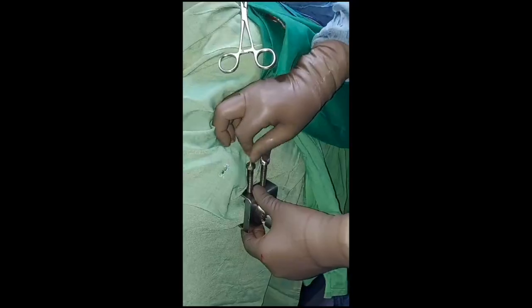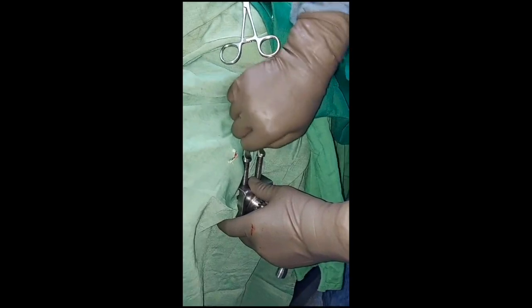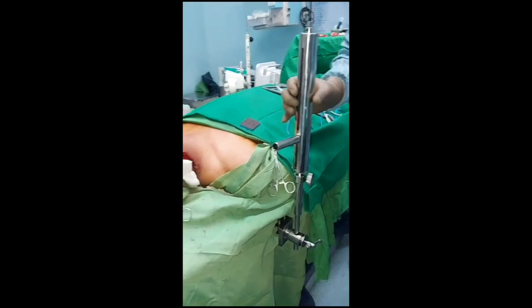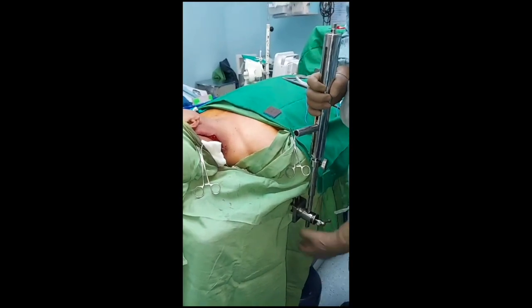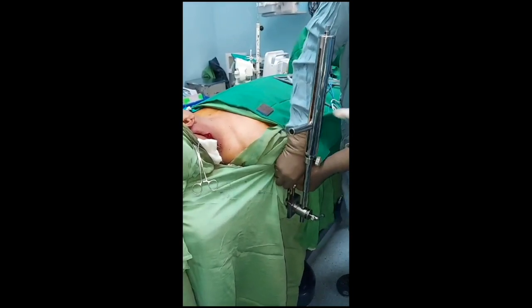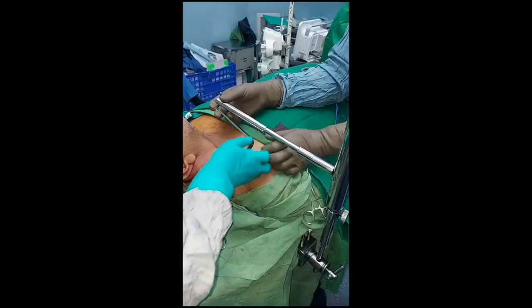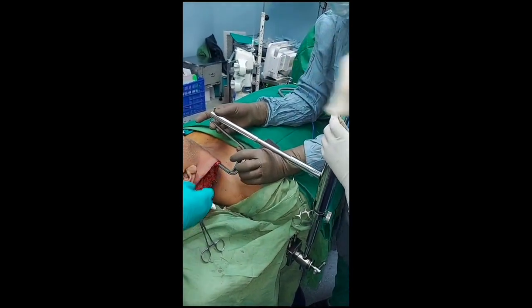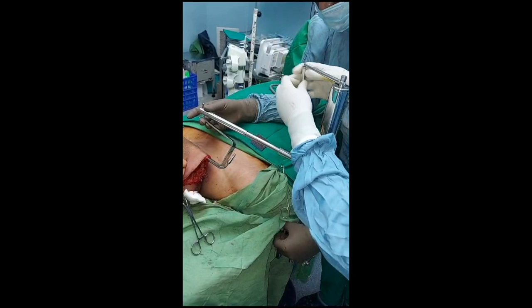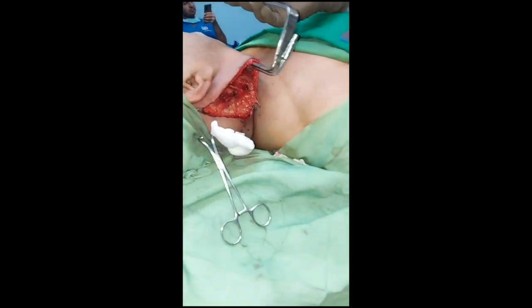Once you raise the flap, the next step would be fixation of Chung's retractor. So this is how we fix the Chung's retractor. Chung's retractor has got many blades, out of which my personal favorite is long one because of its reach. So these are the blades, and we fix the blade like this, and then we finally adjust the traction. This is how it looks after you place the retractor.